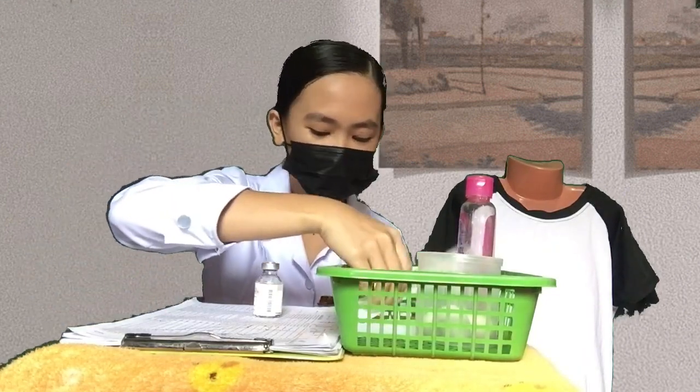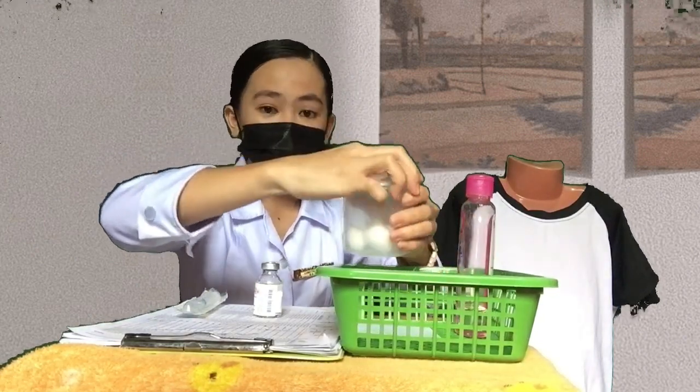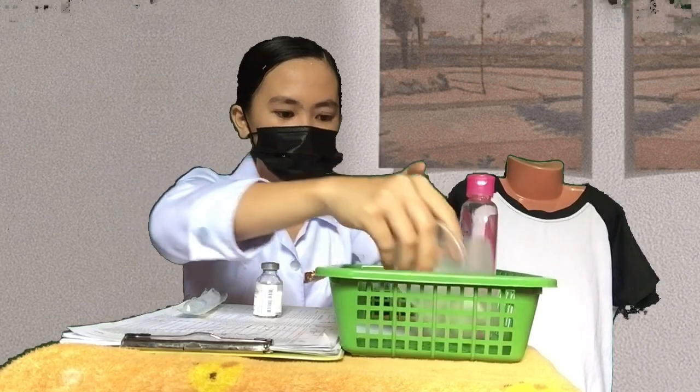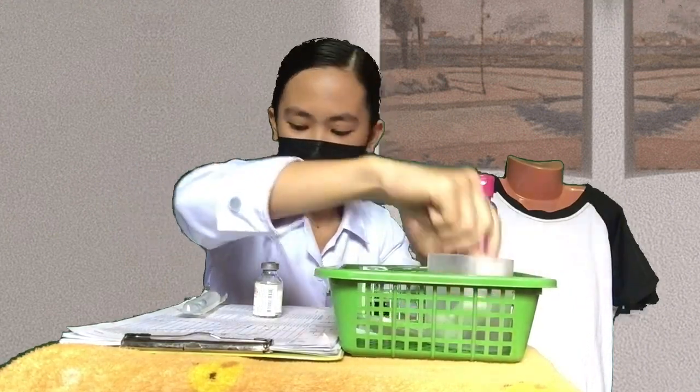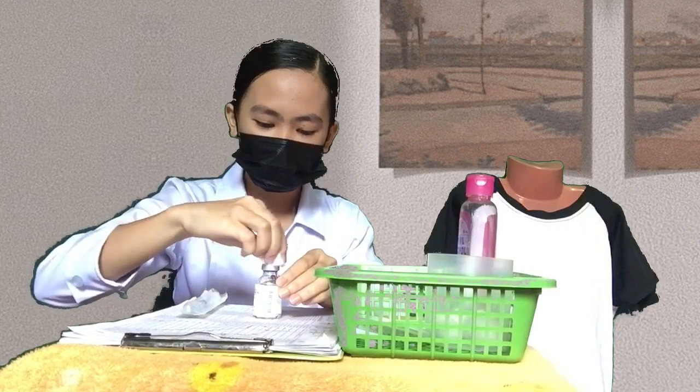So I'm going to get the syringe, but first I'm going to clean the vial using a cotton ball. I'm going to do it in a circular motion to prevent contamination.